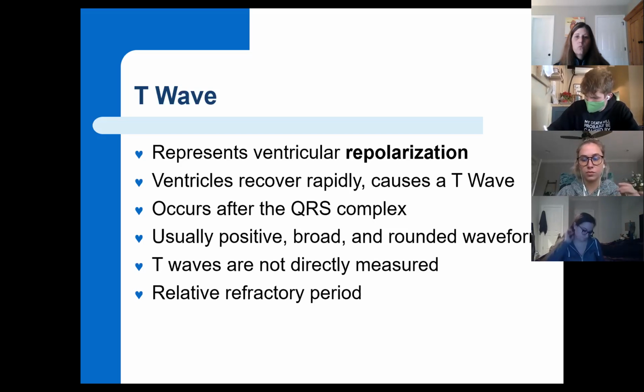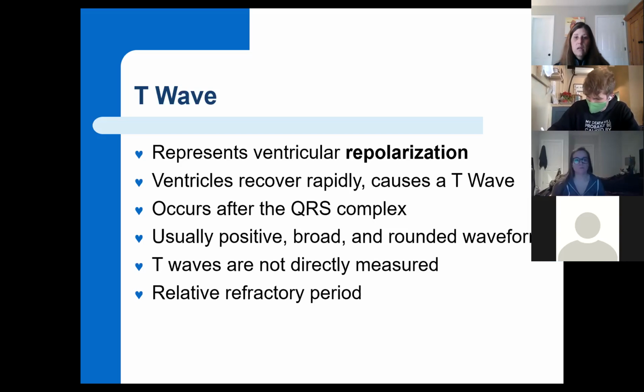When we do cardioversion, we will want to do synchronized cardioversion, because then the machine will identify where it's appropriate to give an electrical shock, and we want it to fire back in the QRS complex on the R, because that's when the ventricles should be contracting, and so that shock would do just that. We don't want it to fire an electrical impulse on the T wave, because those ventricles have to rest.